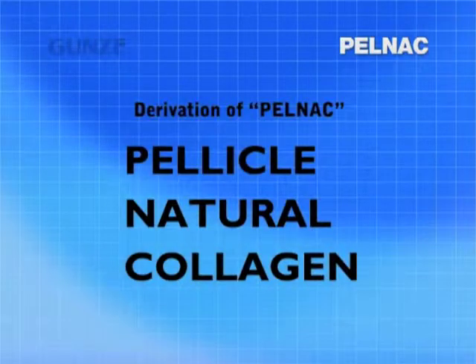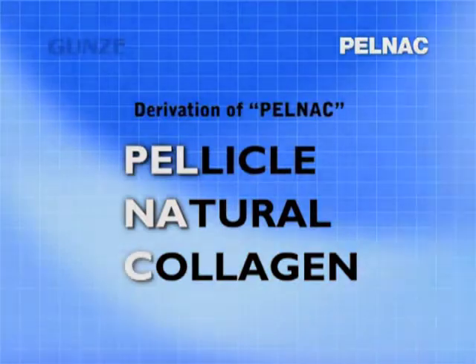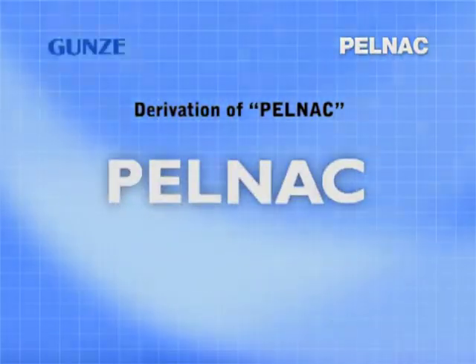The name Pelnac is derived from the first syllables of pellicle and natural, and the C of collagen, to mean a pellicle of natural collagen.